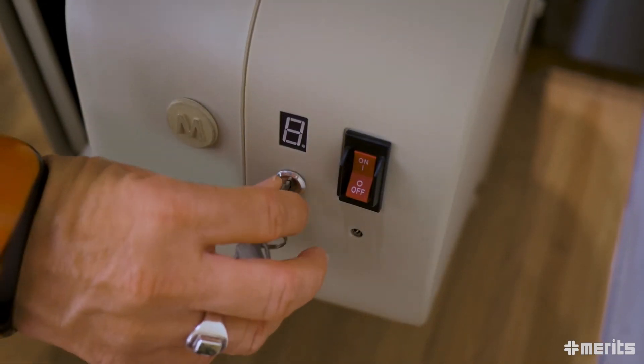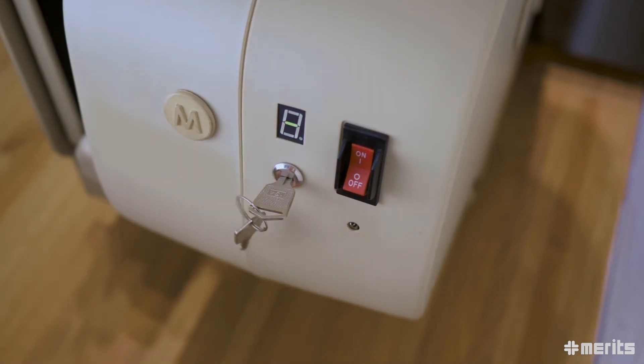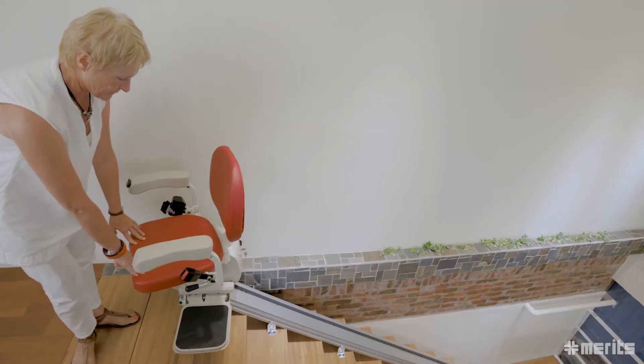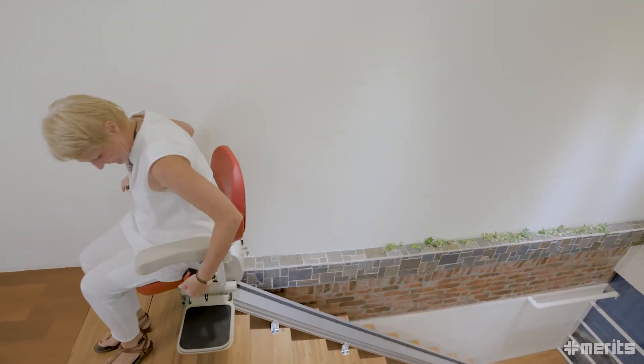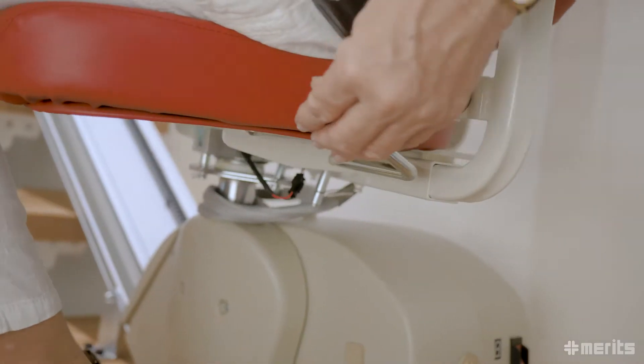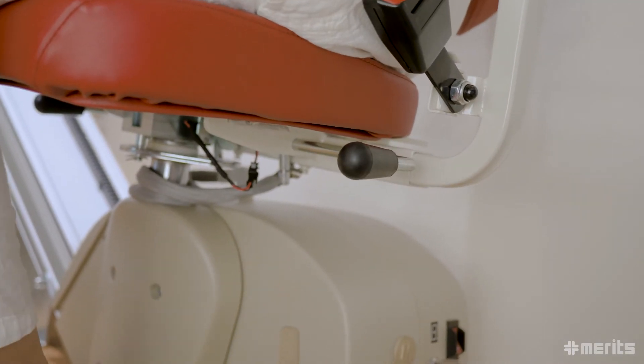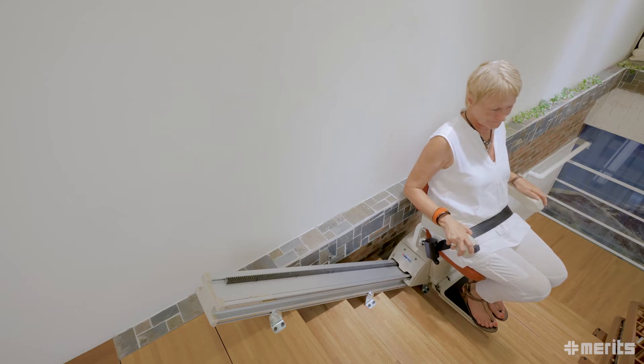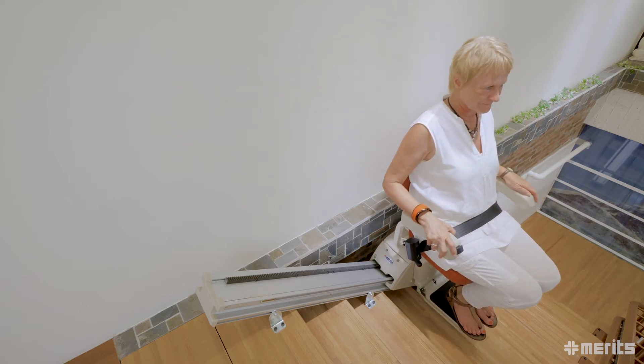The Pilot E603 has many features for additional safety and comfort. The unit powers up via a key ignition for added security. The swivel seat design with locking catch ensures easy entry and exit from the carriage. The unit is non-operational unless the seat has been fully unfolded and turned into the ready position.